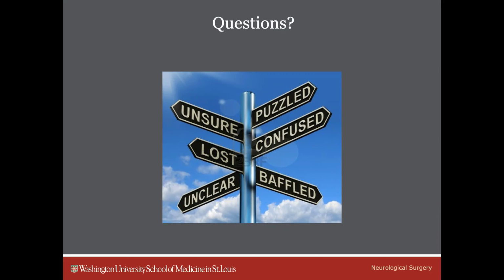Do you think the neuro exam matters at all to that? Yeah, so again, there are 2 ways of looking at it. If somebody has an ICP monitor in place, then it probably doesn't, because you're going by the ICP numbers. And then if the ICPs have been normal, then you want to wean sedation, get an exam. If they follow commands, then you want to take the ICP monitor out, because once somebody starts following commands, their GCS typically is more than 8, right? So they don't have indications for that anymore.